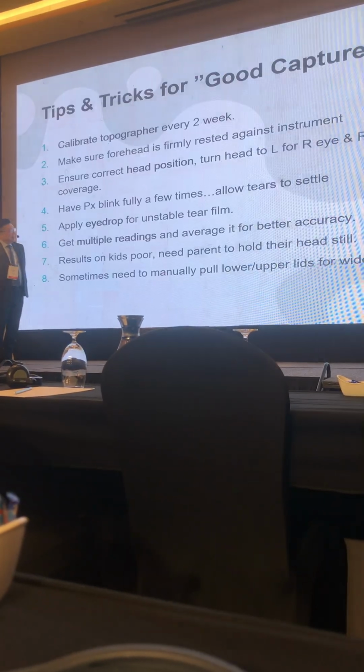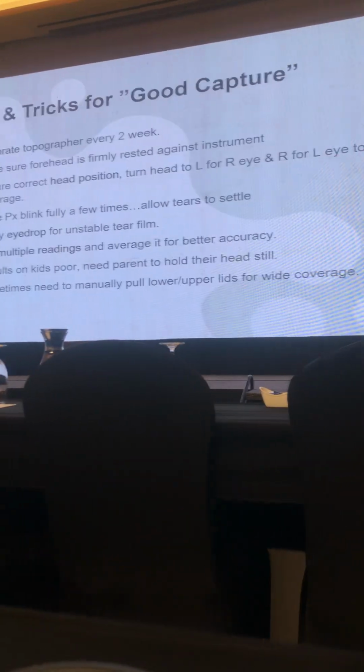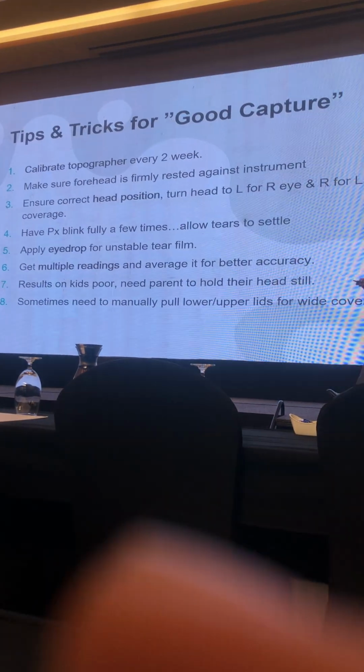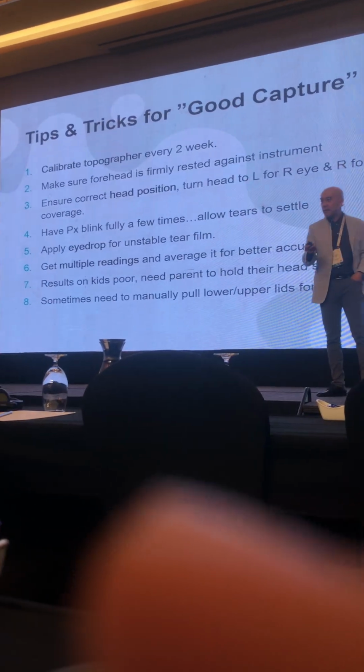Okay, that's the refractive power map. Let me talk about it. Yeah, okay. Good capturing. You want to share? I think we will do it later on.